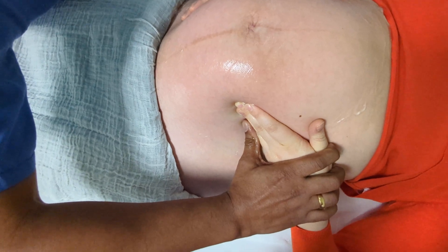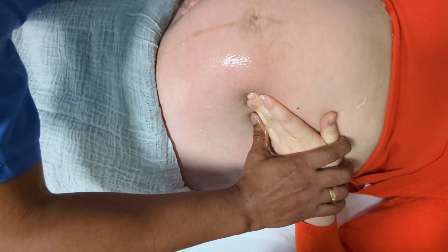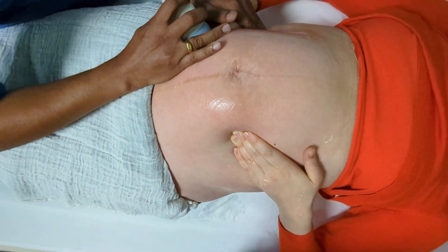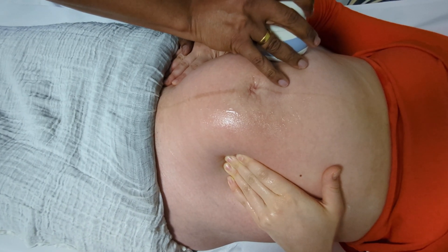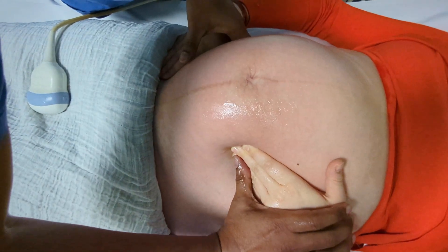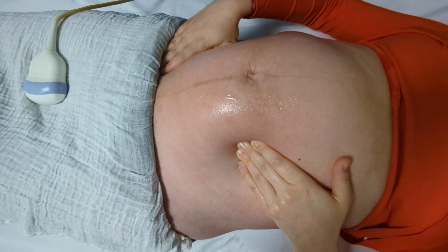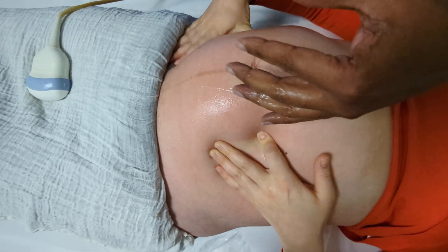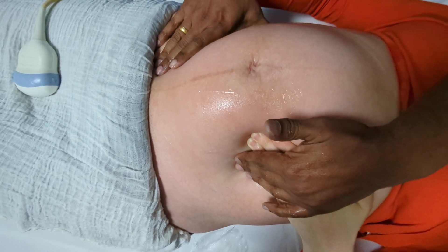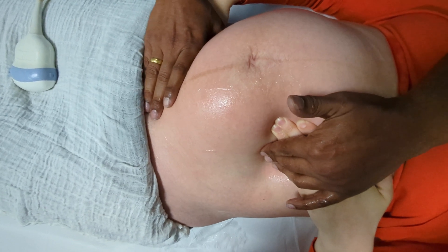If at any point you're not happy, just say so and I'll stop. So you're going to push the bottom up and you're just behind the head. The heart's beating really nicely. Let's continue.